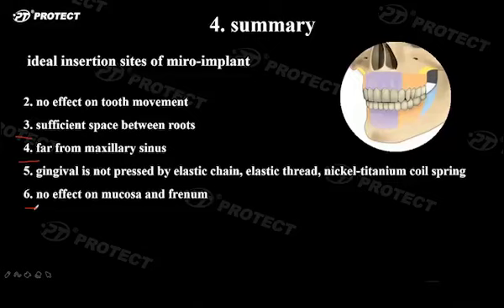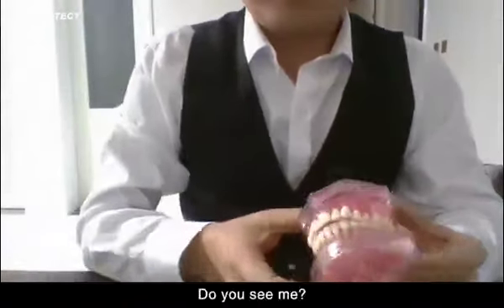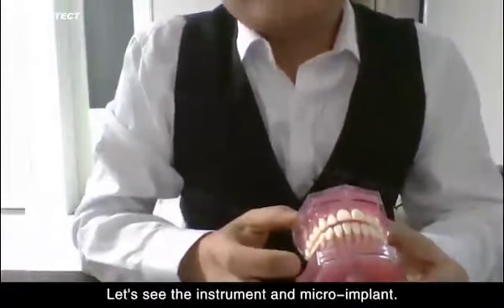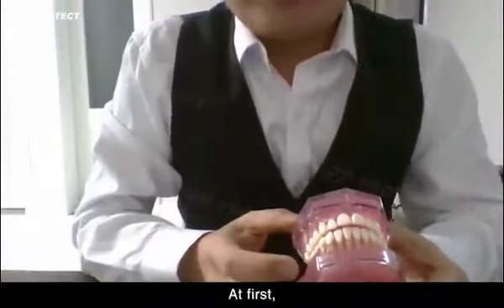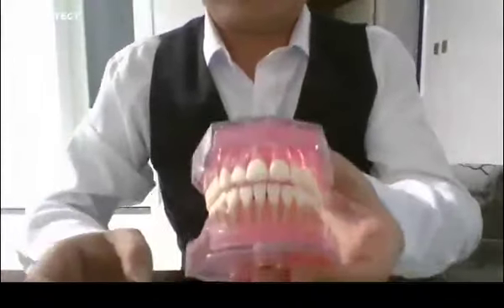Okay, in order to understand them clearly, let's demonstrate the operation. Let's see the instrument and the micro-implant at first. This is a denture model.